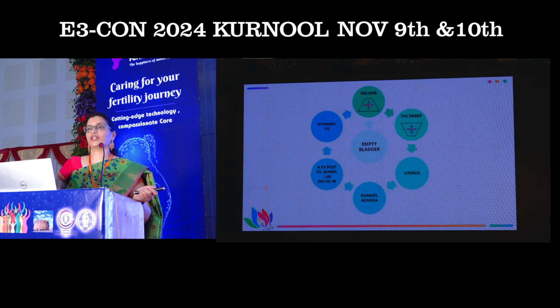And this is just putting everything together. So usually before, we used to first fill the bladder, look at the trans-abdominal, then empty the bladder, come back for transvaginal. So instead of all that, now I just start the scan with an empty bladder. It is okay because we are just looking at it as a screening. So we can always go back. So we start the scan with an empty bladder and then do a trans-abdominal sweep, trans-vaginal sweep of all the organs, and then look at everything in detail. And then by the time you finish the scan, there will be a little amount of bladder filling.